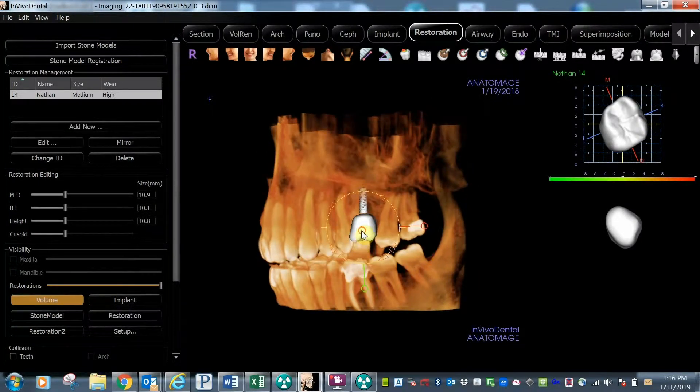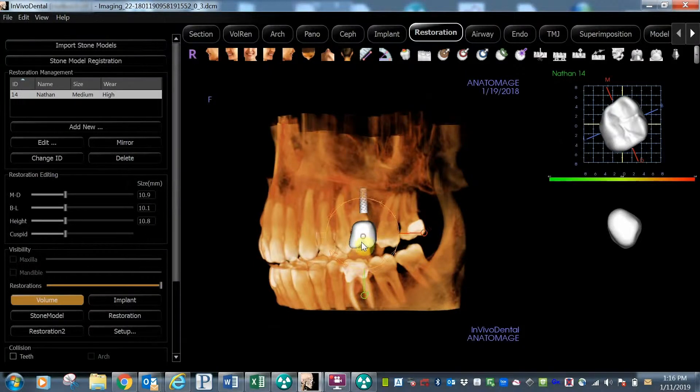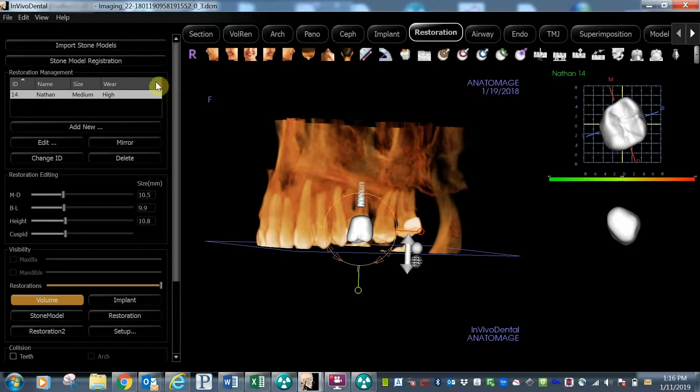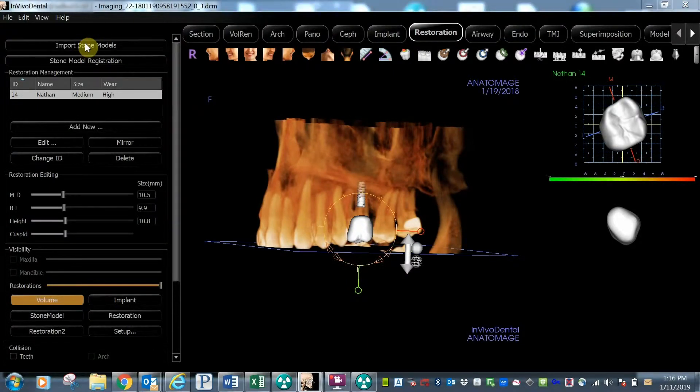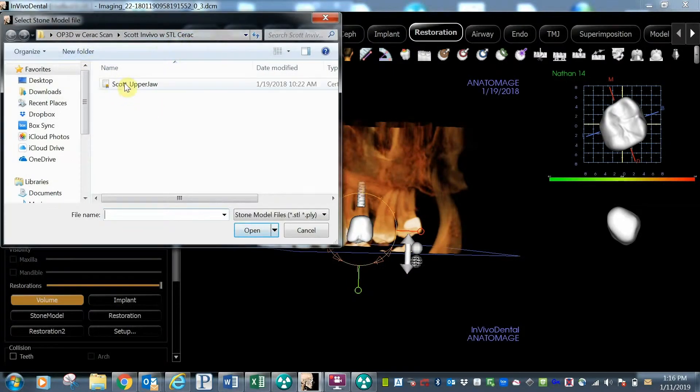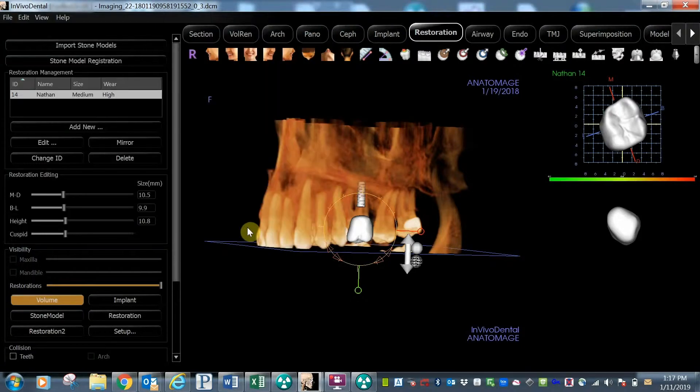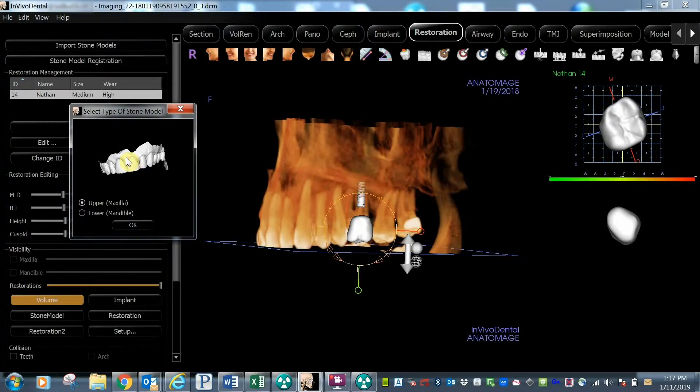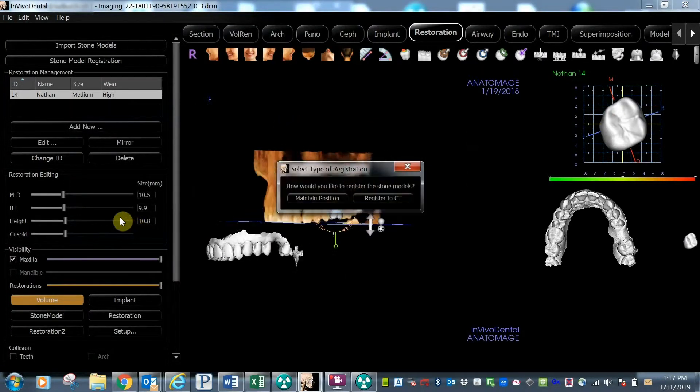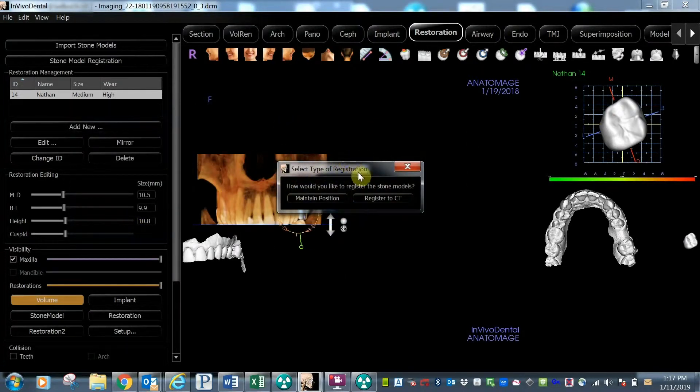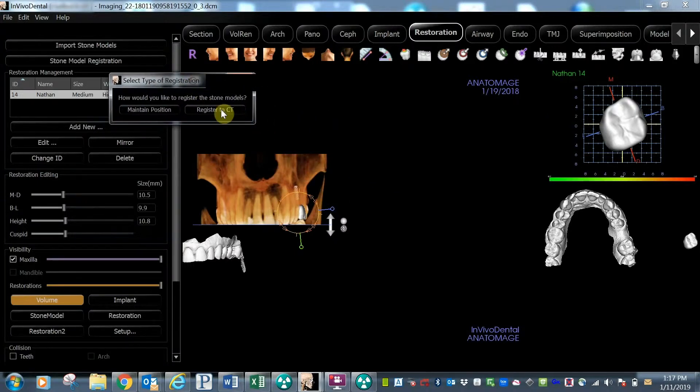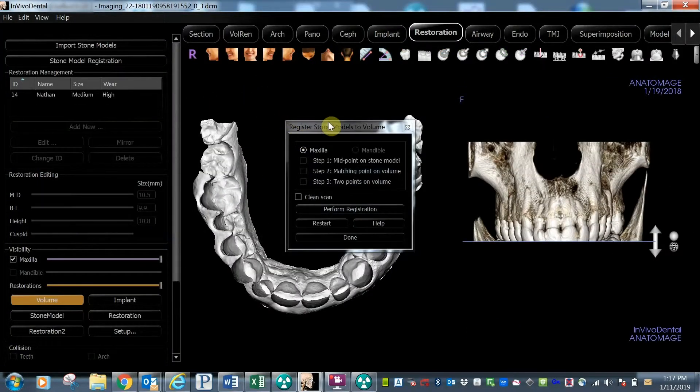Next, import your digital impression or STL. Select the import stone models button and then browse your computer to select the STL file. After opening, simply select whether the STL is an upper or lower scan and then select the Register to CT button.